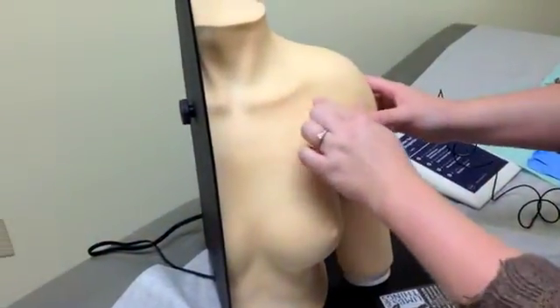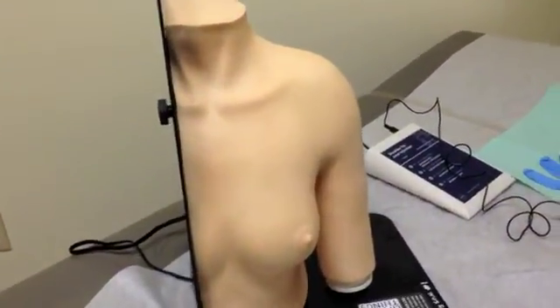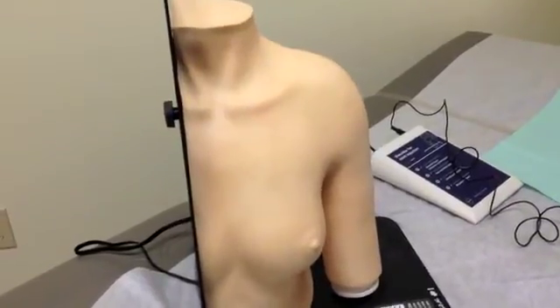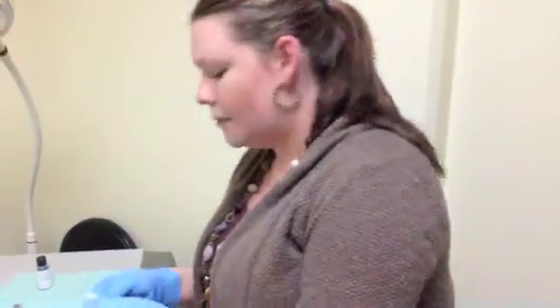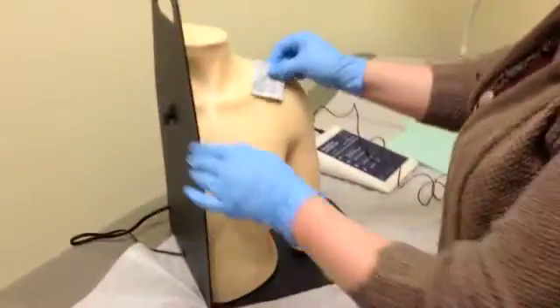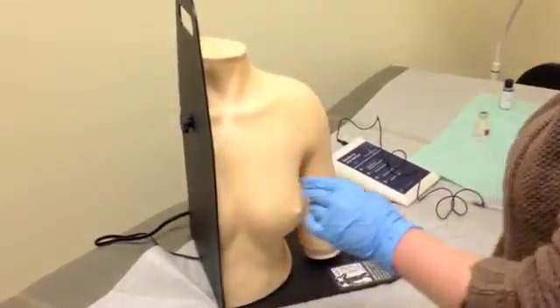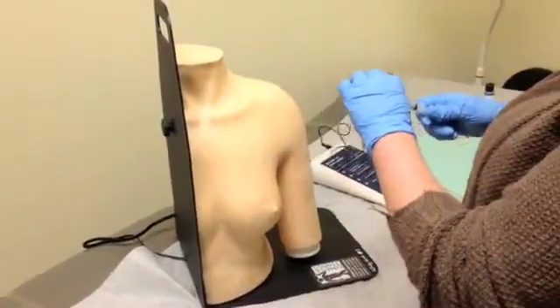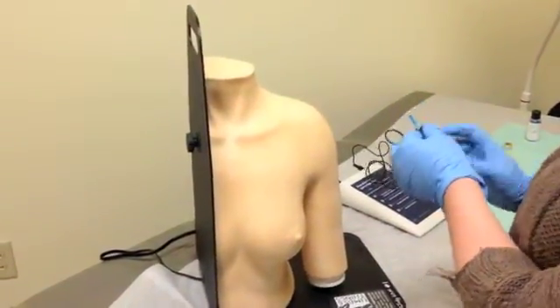So we've marked our area. We're going to go right in here. So I'm going to get my gloves on. We're going to use clean gloves for this procedure. If we were taking a culture or aspirating the fluid, then we would go ahead and use a sterile technique. So for this one, we're going to use an alcohol pad, and we're going to just clean the site. And then we have our solution that's already pulled up in our 27 gauge 1.5 inch needle.